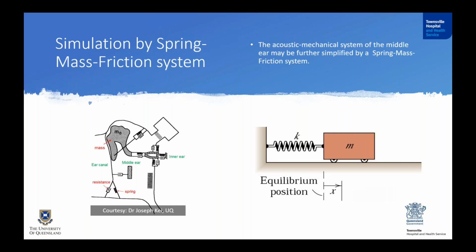Now, in this system, the spring components of the middle ear store energy whenever there's a forward pressure. Then when the tympanic membrane goes back, or when they recoil back to their position, they reflect a lot of low frequency energy. So the stiff components of the middle ear system, the spring component, reflect a lot of the low frequency energy. On the other hand, the mass component of the middle ear reflects a lot of the high frequency energy back.